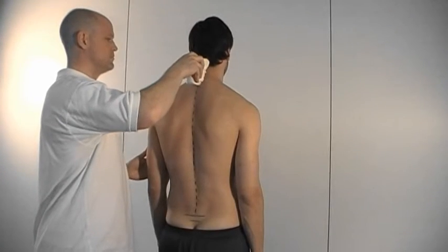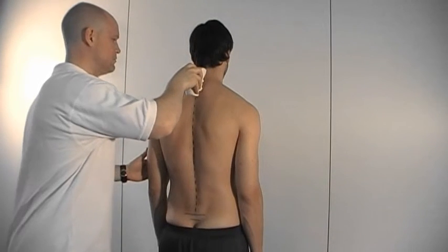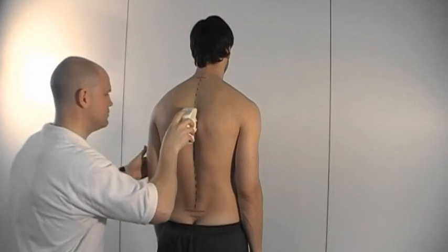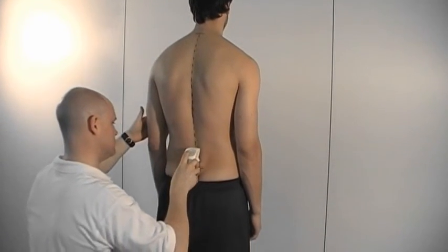An easy way to record uniformly is to position yourself behind the patient's back. Start the measurement and proceed by bending your knees while gliding the spinal mouse along the spinous processes.